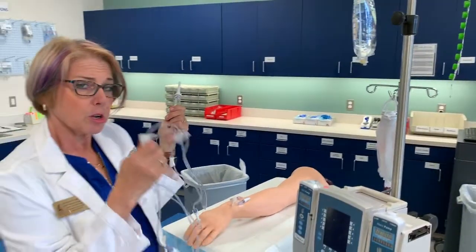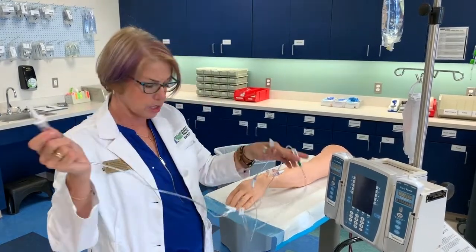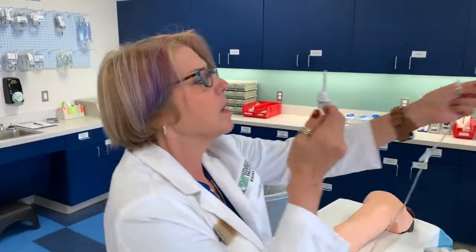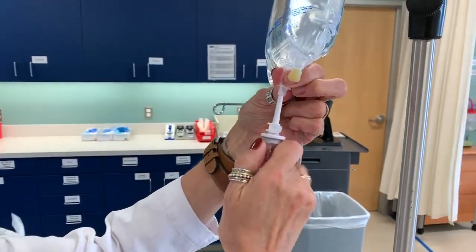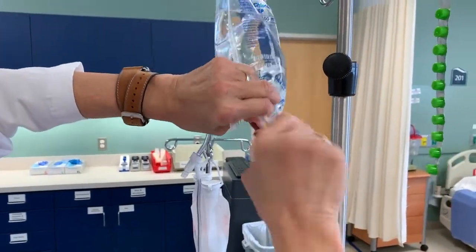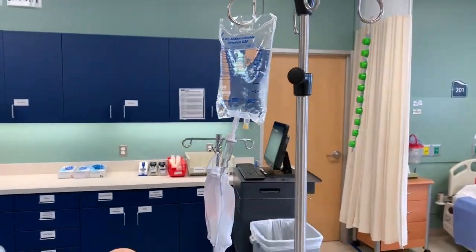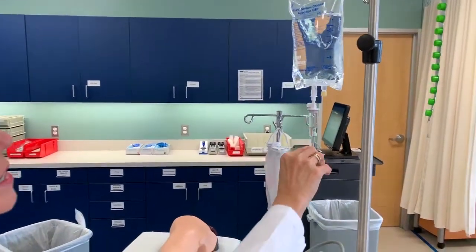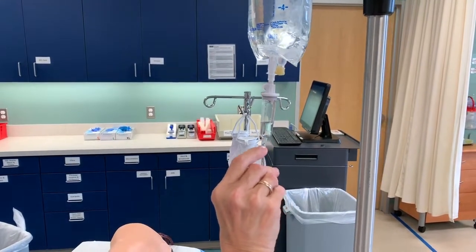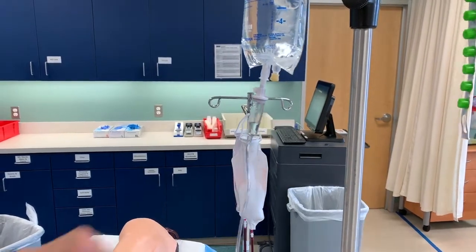Now, important step here, you want to go ahead and close the roller clamp, because if we go ahead and insert this into the bag, it's going to start running for us. So we want to remove the top of our port here, maintain good sterile technique, and go ahead and slide this in. And sometimes they're a little stubborn. Just twisting motions. The next thing, you want to squeeze your drip chamber and allow some fluid to get in. Every tubing usually has a line on here, but we want to have enough fluid in there to be able to drip, but we also want to see our drops fall so we can count appropriately.